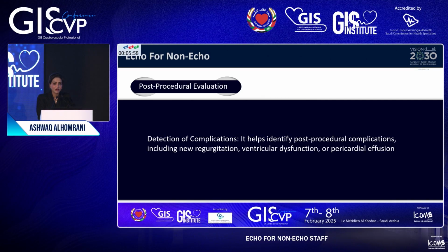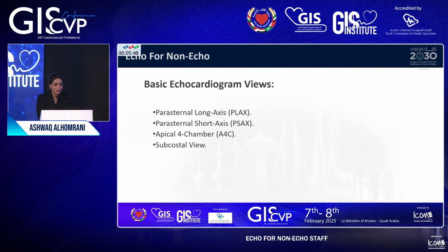Before we put the patient in recovery, sometimes the doctor likes to check if there is any complication after the procedure.